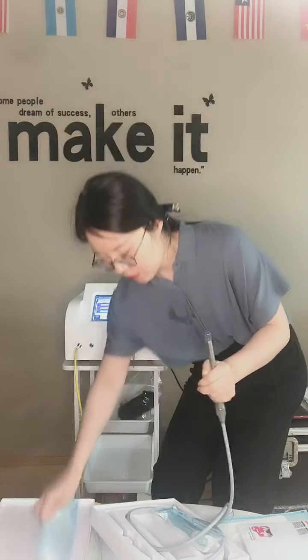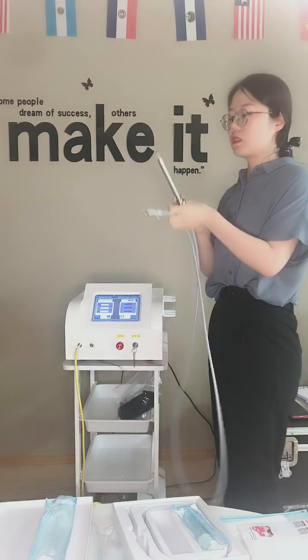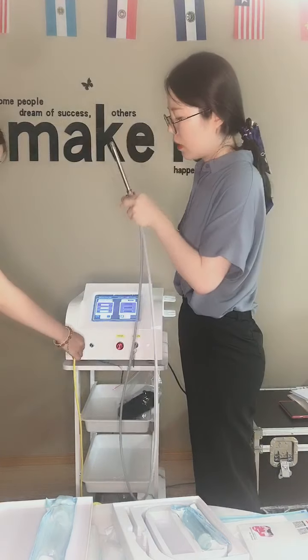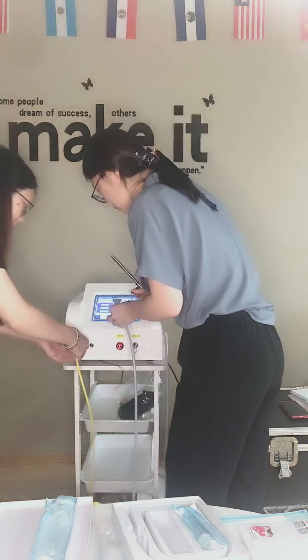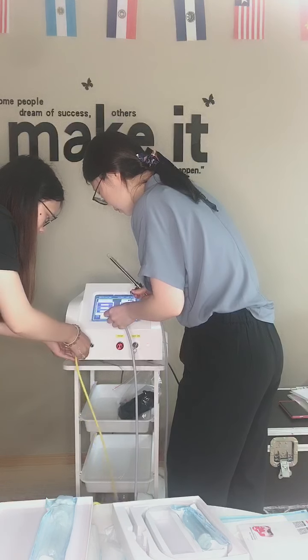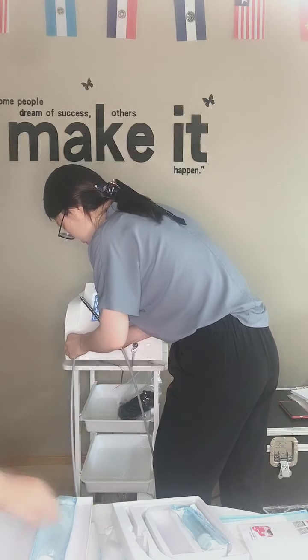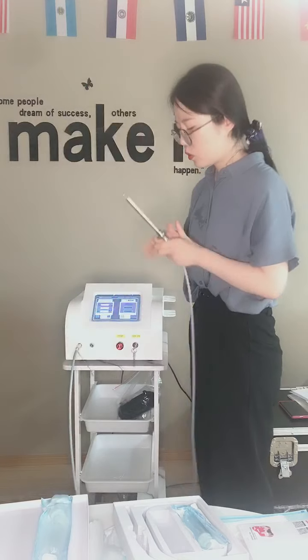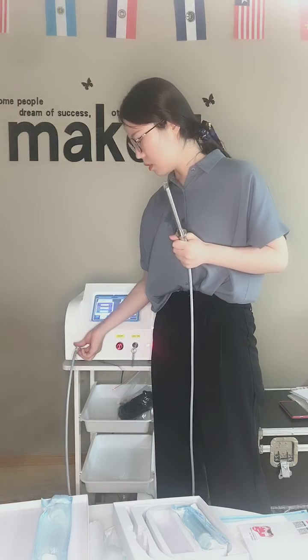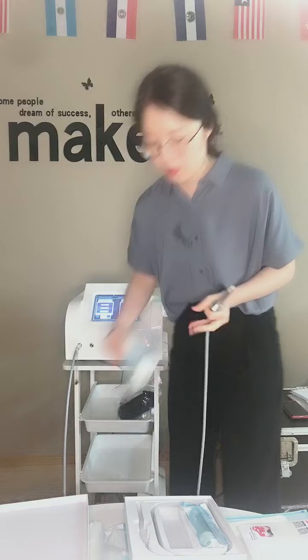Okay. First, I need to install the handpiece on the laser machine, with the SMA 905. It's very easy to install the handpiece. The part that matches is the same as the others. And next, I will show you how to put the glass tube outside of the handpiece.